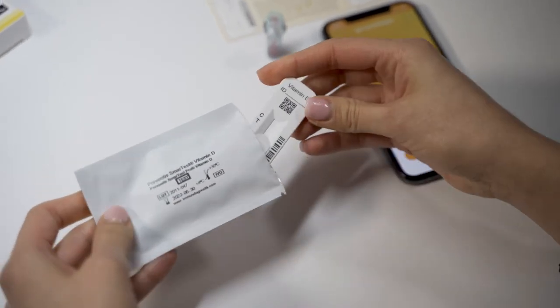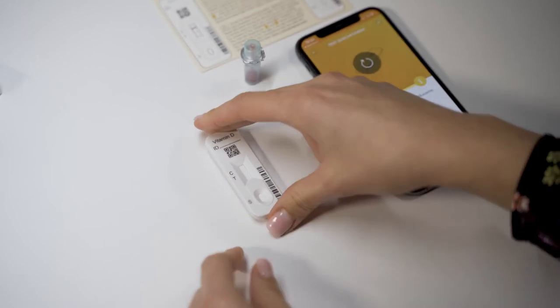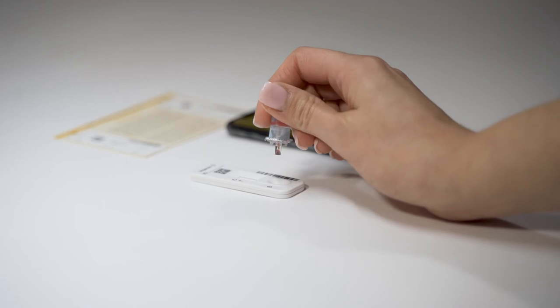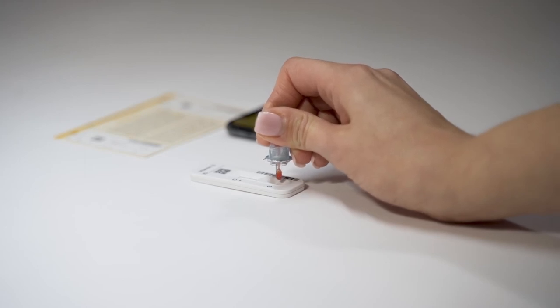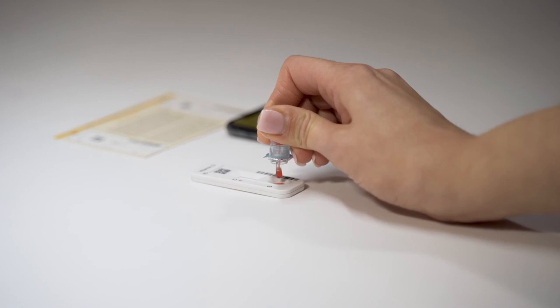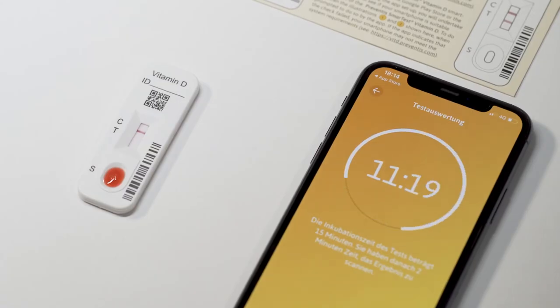Now remove the test cassette from its packaging and place it on a flat dry surface. Remove the safety cap of the capillary and hold it approximately one centimeter above the sample application window S. Allow four hanging drops to fall onto the sample application window S of the test cassette — this is the only way to ensure the correct buffer volume. Then start the 15-minute timer. Do not move the test cassette during this time.